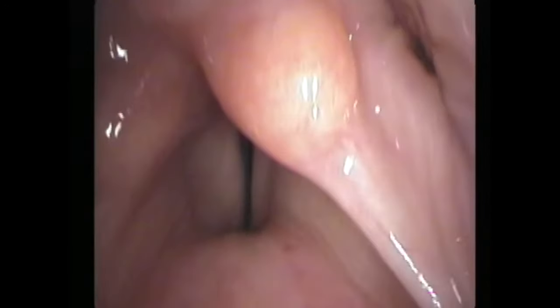We're going to watch the onset of phonation, and watch the right side move medially and rotate the vocal process inward, while the left side tends to translate but does not rotate inward. This is most apparent when we slow the video down. Notice how the vocal process on the right is leading, while the vocal process on the left is lagging, both in speed and in angulation.